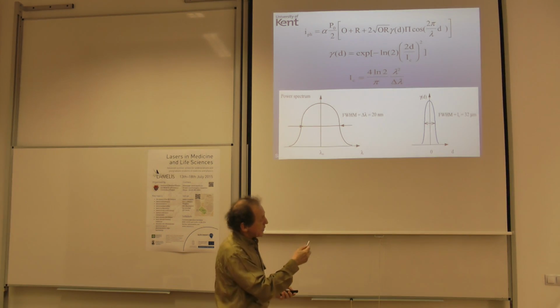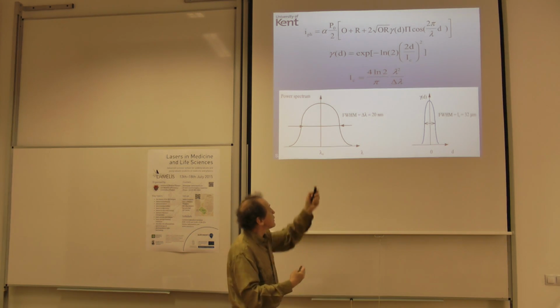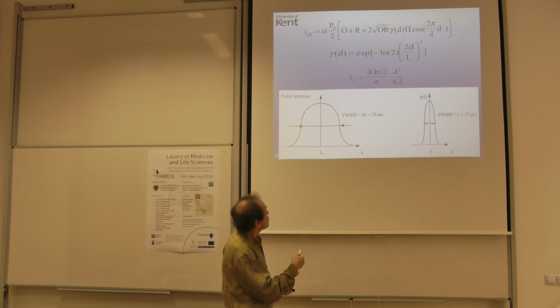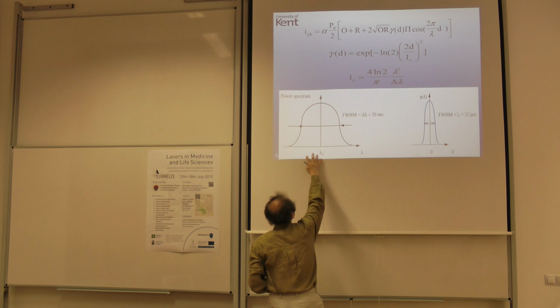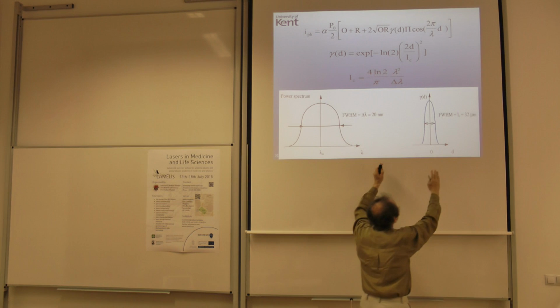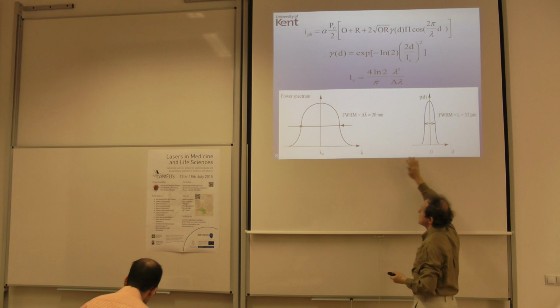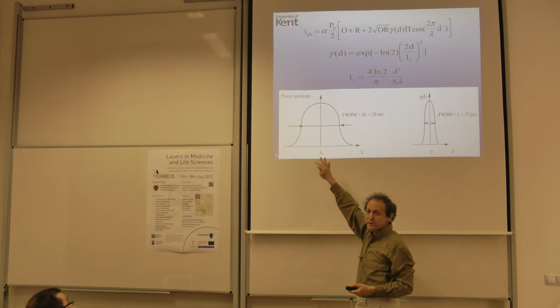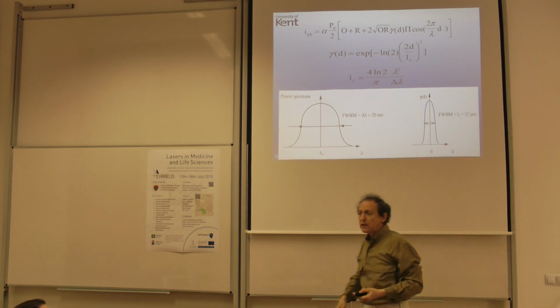The first equation is the interference equation, and the third term gives you the fringe pattern. The fringe, and that's what the image is. The image is in this 2 square root of OR, O being reflectivity of the object. But the key is here, because here you have the spectrum, so the more colors you put into the spectrum, that's what I told you initially, by Fourier transformation it will become narrower and narrower, and that is in space. So the more colors, the larger spectrum, the better would be the axial resolution.